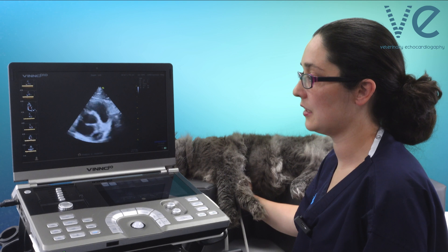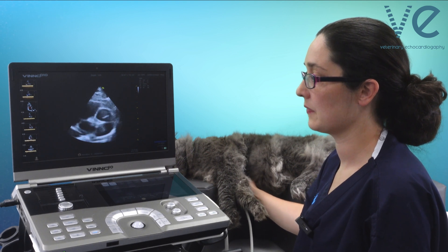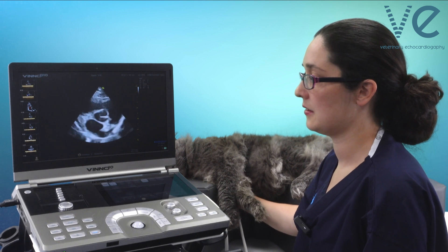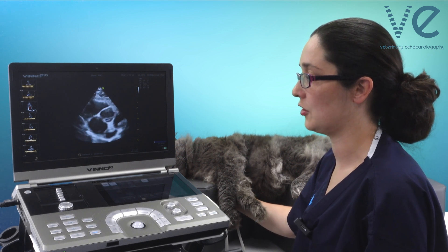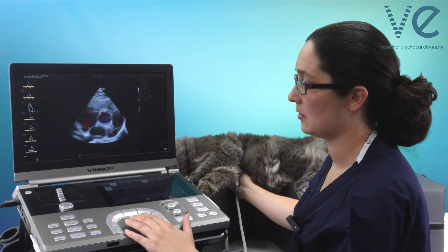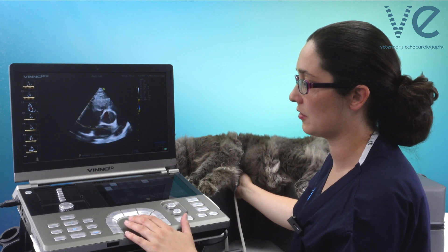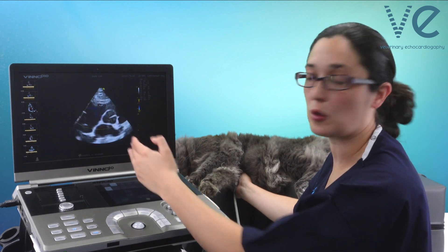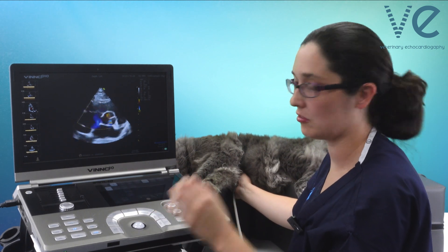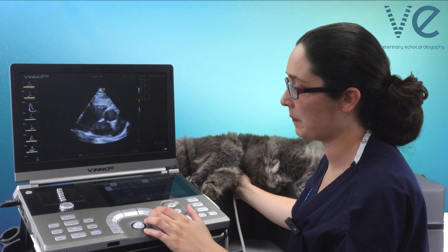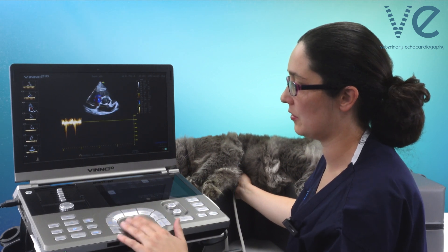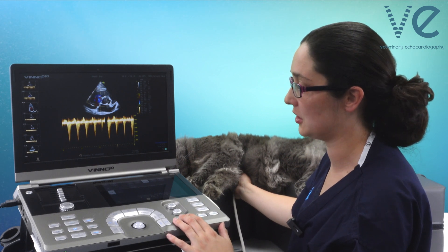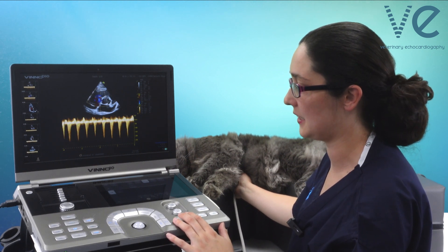So I'll turn to the short axis now. I'm at the basal short axis and I want to try and get a nice view of the tricuspid valve. I'll put in colour over the tricuspid valve here. I'm going to centralise it a little bit so that my continuous wave Doppler beam can go straight down the middle of my screen to really optimise that angle. And now I'm going to put that down through the regurgitation — and this is much better. I can already see I'm getting a much stronger trace, a much denser waveform.